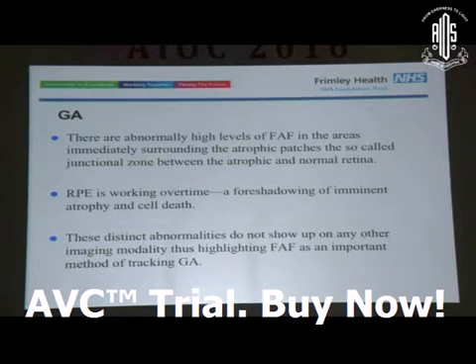Now, in geographic atrophy, there are abnormally high levels of fundus autofluorescence in areas which are immediately surrounding the hypofluorescent areas. So for example, if you see the black area, you will see an area just surrounding it which has hyper-autofluorescence. And this is called your junctional zone.